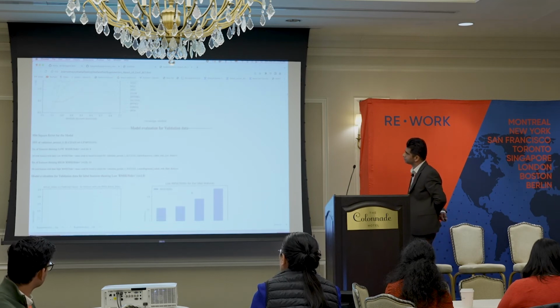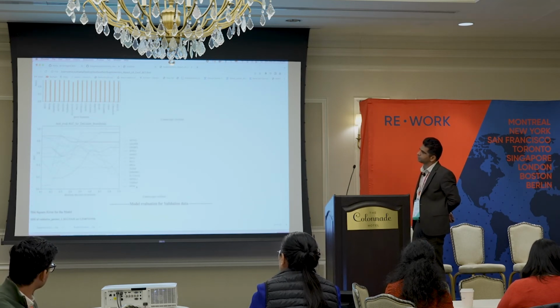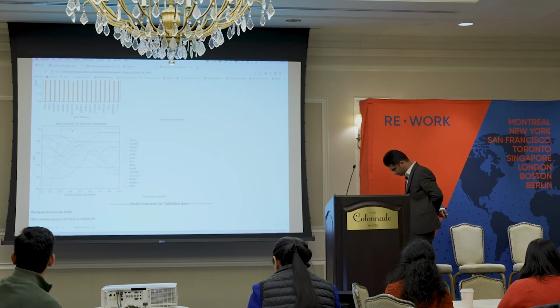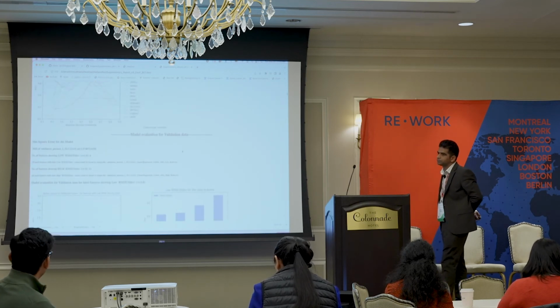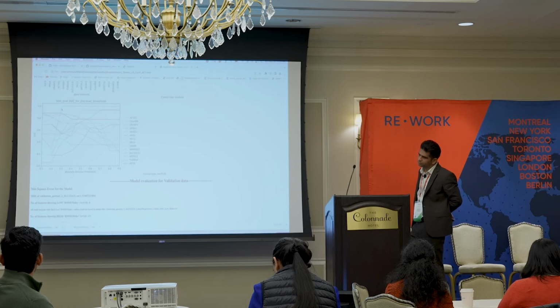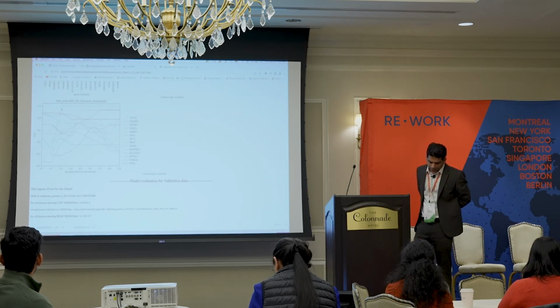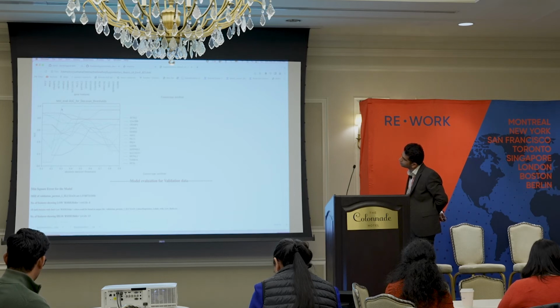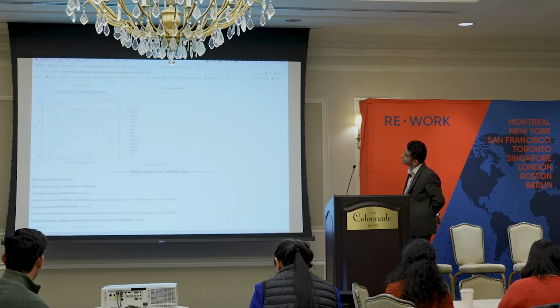Further, you have more validation data running permutations through each of these labels, only through the labels that have higher AUC, that is greater than 0.9, and R square greater than 0.25, such that you know whether this data is randomly performing to be very accurate or it's actually confident with the strong p-values that we achieved, which were even less than 0.002, such that it gives you confidence in the label predictions using the imaging features.